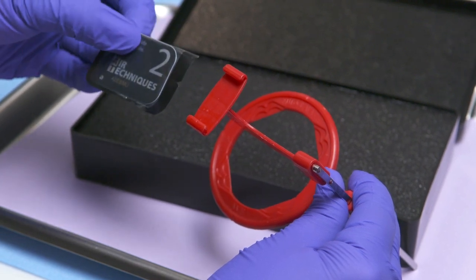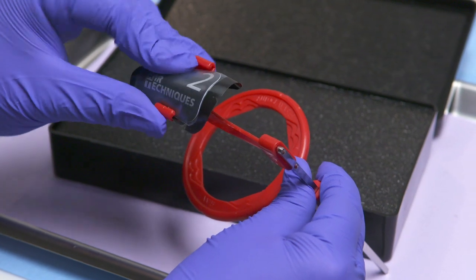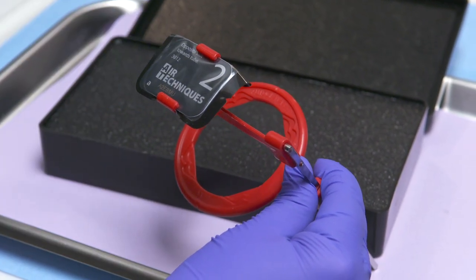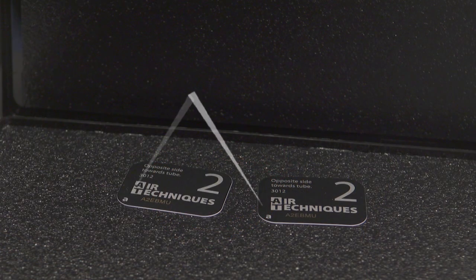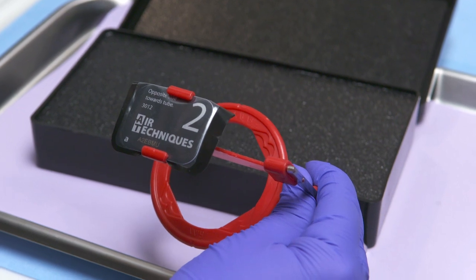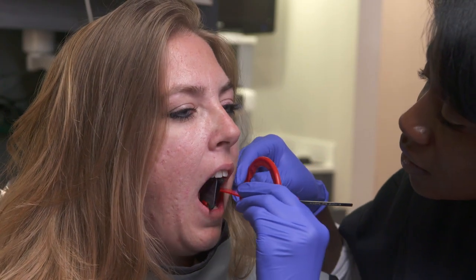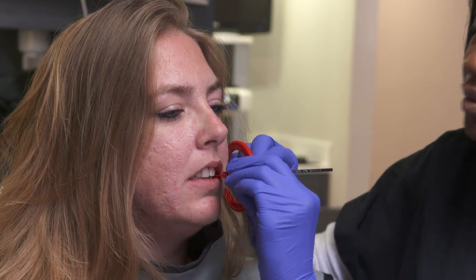You can continue to use your existing film holders. You might need to fold the barrier envelope to fit inside the holder. If you're using alligator clips, make sure you file down the teeth. On the printed side of each flexible sensor is the letter A. Position it so that you can read the letter A without being inverted. Place the holder with the flexible sensor inside the patient's mouth with the opaque side of the envelope facing the tooth.